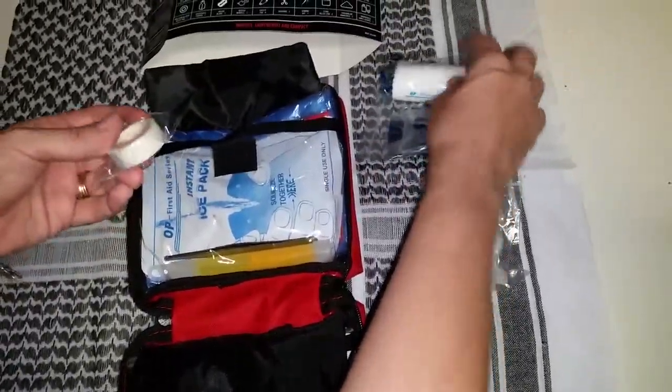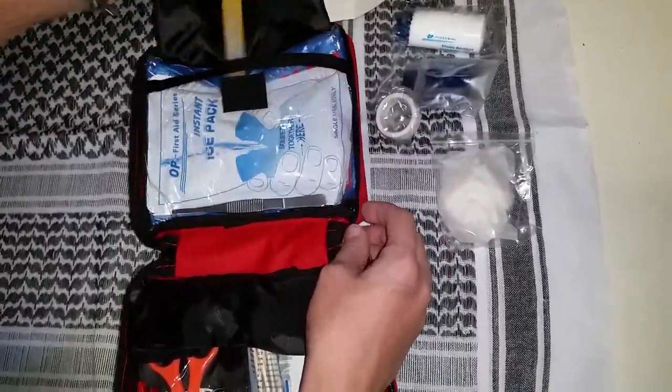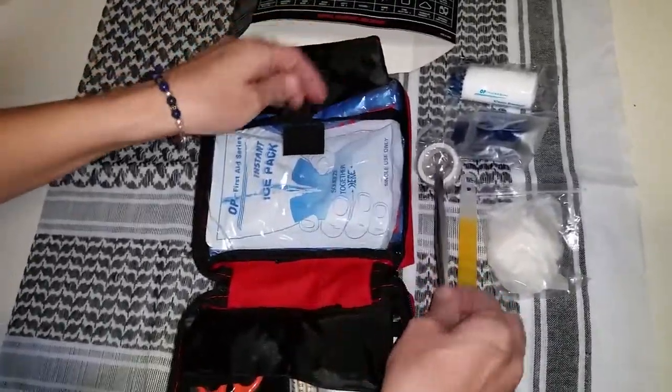Elastic bandage, gauze, a little bit of medical tape. Glow stick — that's always handy. And a nice big set of tweezers.